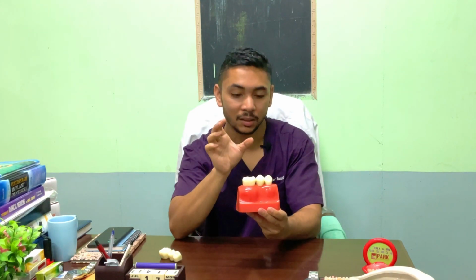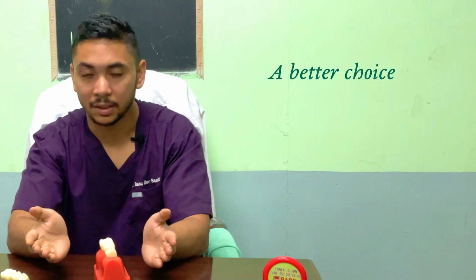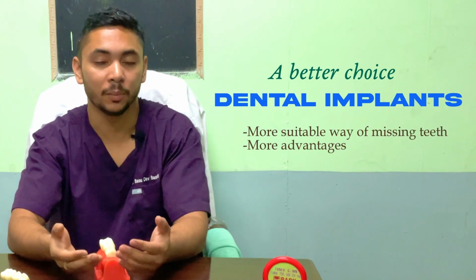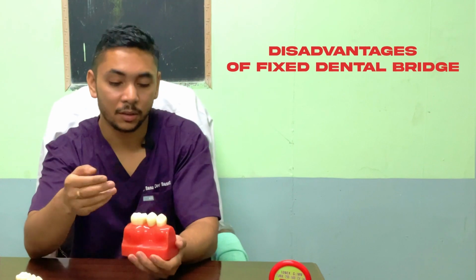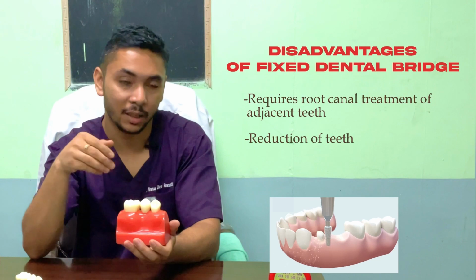Now we know the two ways in which we can replace a missing tooth. Let's talk about some of the advantages and disadvantages, which option is better and which option we should go for. When you compare both the techniques, dental implants are the most suitable way of replacing a missing tooth, and they have many more advantages compared to the conventional fixed dental bridge. Let me try to explain some of the advantages of dental implants over a fixed dental bridge. As I said earlier, in a fixed dental bridge we require the root canal treatment of both the adjacent teeth, and we have to reduce these teeth.